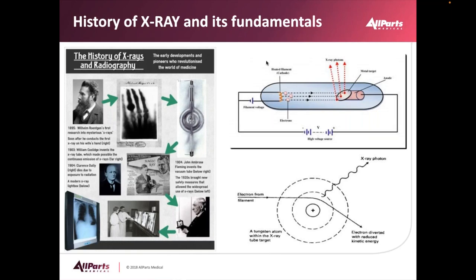Medical X-rays are produced by letting a stream of electrons come to a sudden stop at a metal plate known as an anode. Images produced by X-rays are due to the different absorption rates in the different tissues and bone. The calcium in bone will absorb most of the X-rays, and on the image it looks very white, whereas fat and soft tissues absorb less, which makes them look gray. Air absorbs the least and looks black.